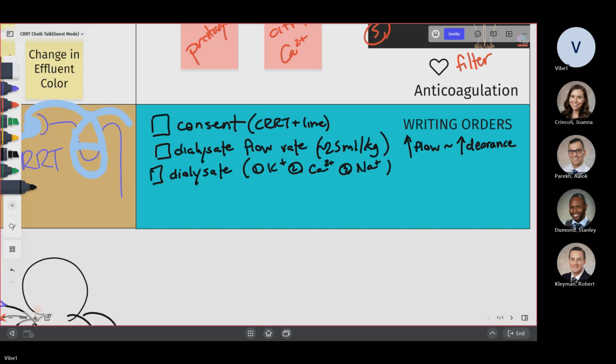Similarly is the blood flow. You can use the parameters. Usually for CRRT, we choose it anywhere between 150 to, you can go up to 400. Regular dialysate has a flow of around 400 mLs per minute. When you are doing CRRT, you're using less flow rates. So usually you can choose an option between 200 to 250.